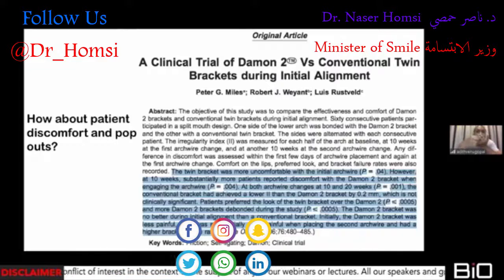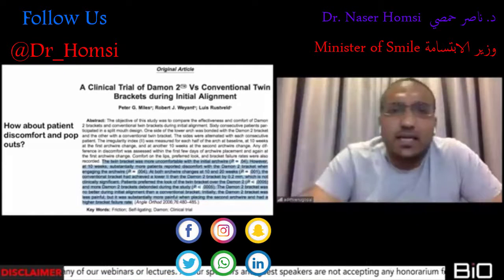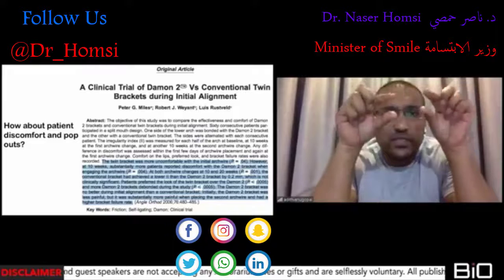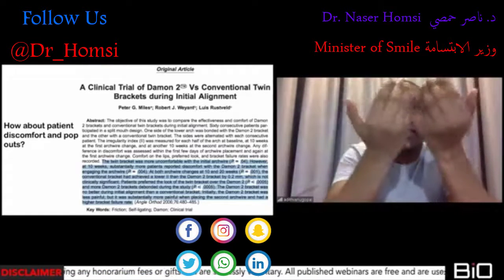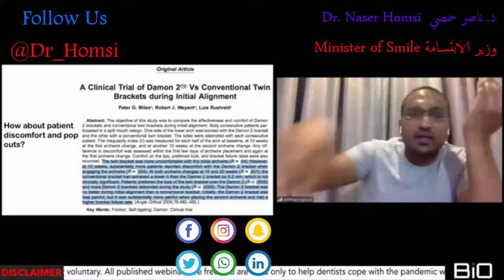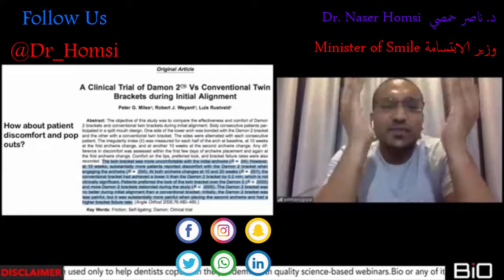And when you have those big bulky brackets, the self-ligating brackets, and you pass an 014 wire or an 016 copper nickel titanium wire, even after about 10 weeks, if you don't change the wire, the teeth are still like this because the brackets are just too bulky. The slot is just too big for that small wire to actually give a deflection, because in ortho the forces are generated by the deflection on the wire. Now, if the wire itself is going straight, although the teeth are rotated, it's not going to derotate.